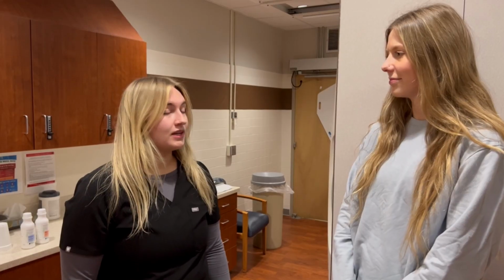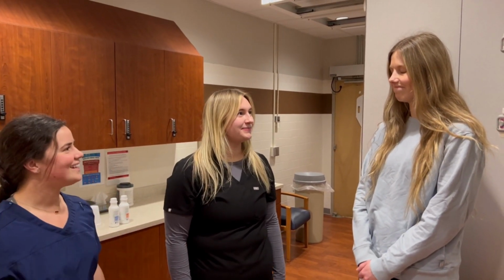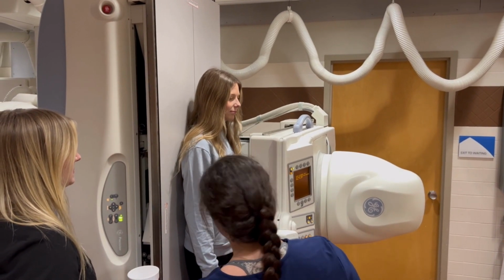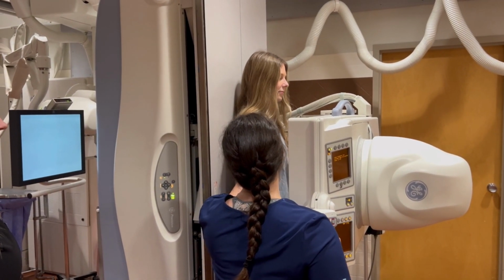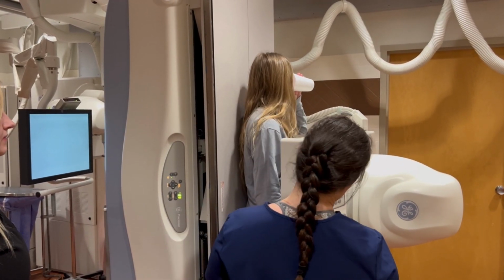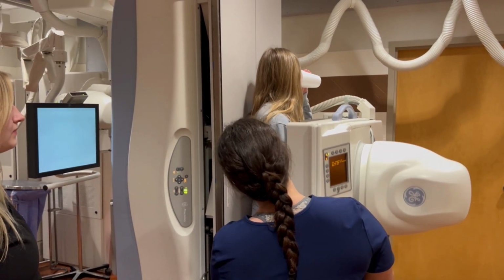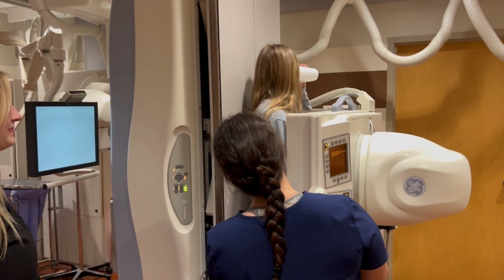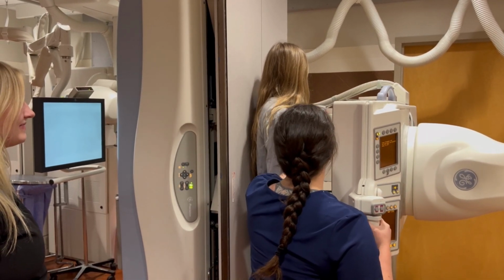Okay. It looks like the radiologist is here. Miss Jackson, this is Dr. Ray. Hello, let's get this exam started. Alright, so this is just going to come a little closer to you. And then I'll take that and I'll put that in your hand. I'm just going to turn you a little bit and I'm going to have you drink, okay? Alright, you can stop drinking. Now I'll take the cup.